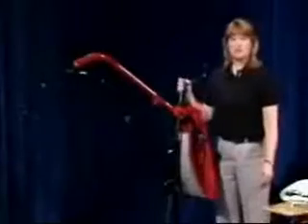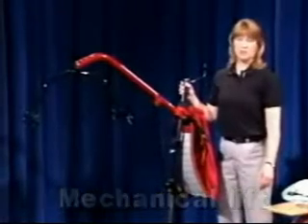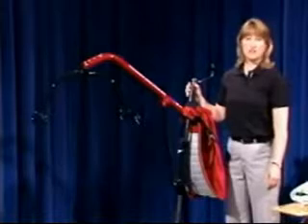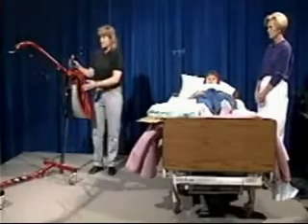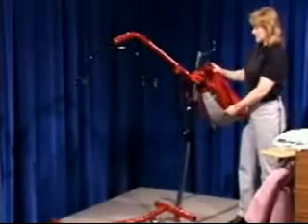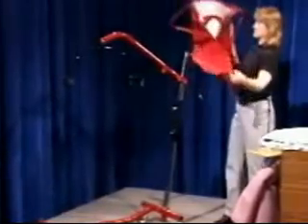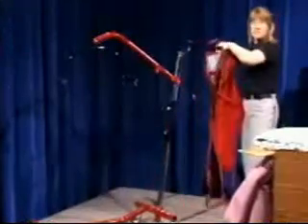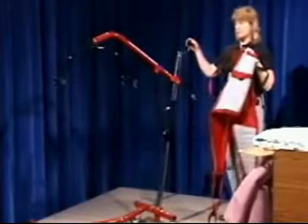Now, a mechanical device is used on patients where other types of transfers aren't appropriate or where they just wouldn't work. Sometimes the patient is completely immobile. Sometimes they're just too large and it wouldn't be safe to do a 2-person transfer, and then they need a mechanical lift. A mechanical lift is something that usually involves the lift and a sling. The sling is used to position the patient on. They're usually positioned in the middle of the sling. And then there's chains that hook up to the corners of the sling. And then this sling is raised and lowered off of the surface using the mechanical lift.